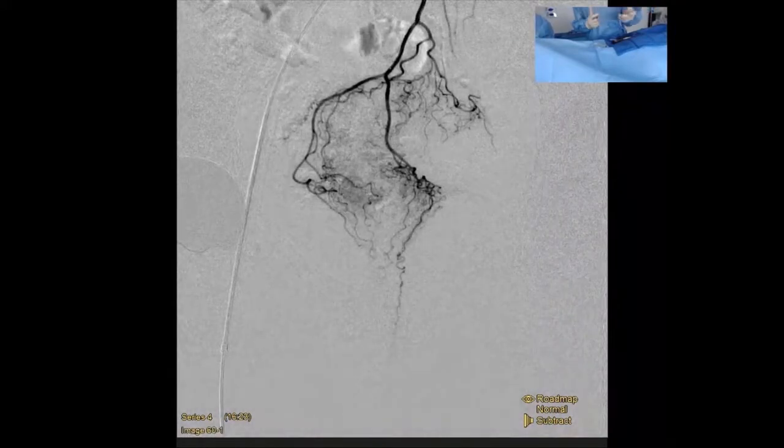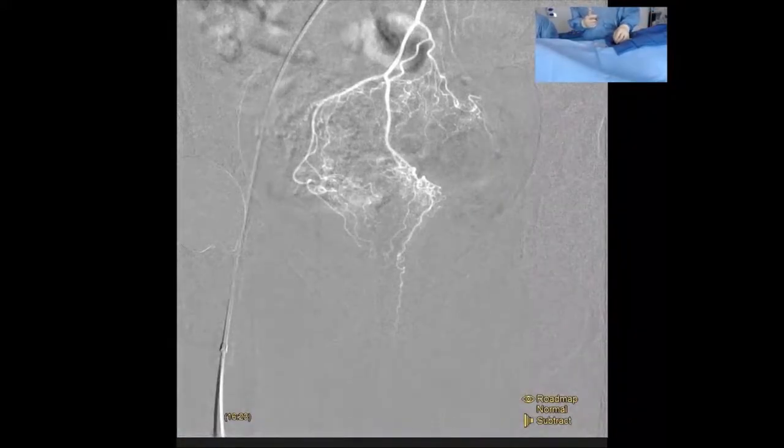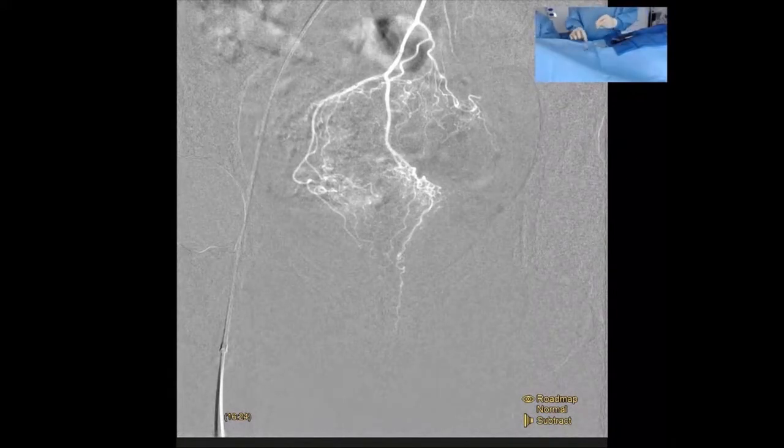Yeah. So we'll definitely want to target that artery, but as a female, she typically has these smaller size arteries that we identify, right? I just happened to take the right because it went to the right first. And then we're going to use the wire and go further distally down that right superior rectal artery.